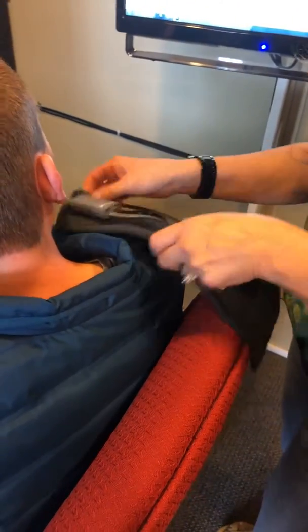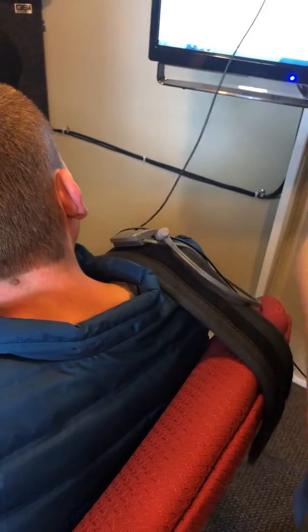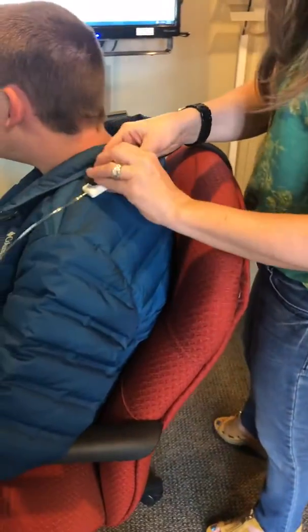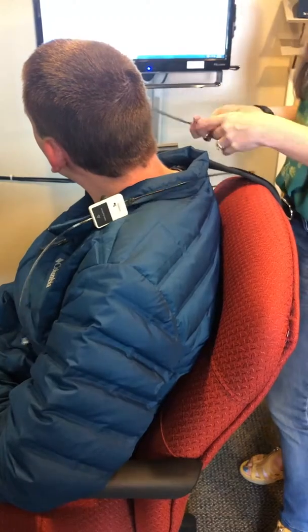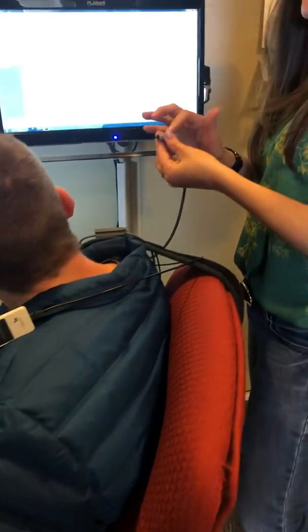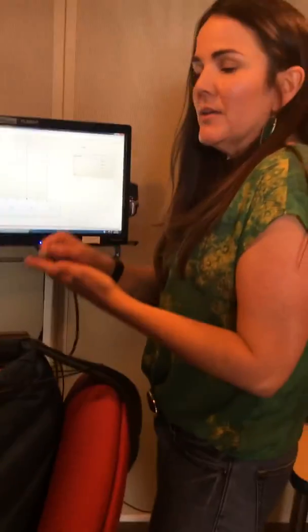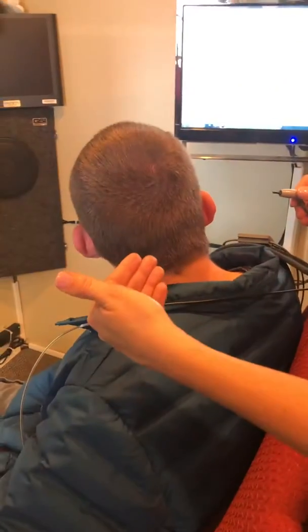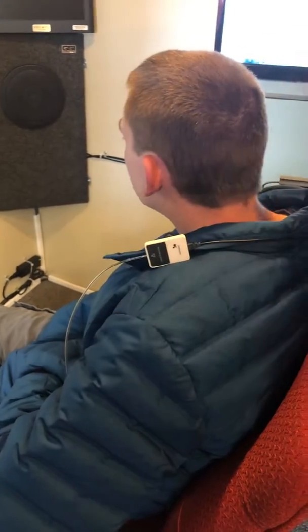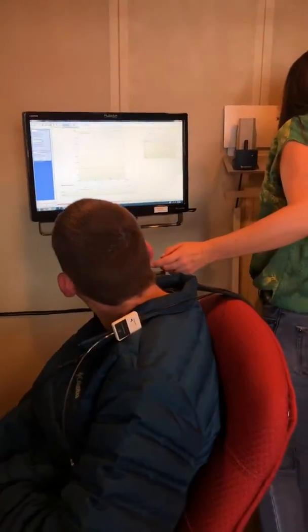You place the probe on the shoulder of the test ear. This side is for contralateral acoustic reflexes. Remember when we talked about acoustic reflexes — the probe is emitting the sound and also doing the measuring for tympanometry. This gives you the ipsilateral response. For contralateral reflexes, the patient hears the tone on the other side, but the probe is measuring the reflex on this side.